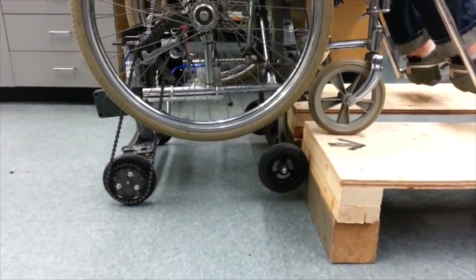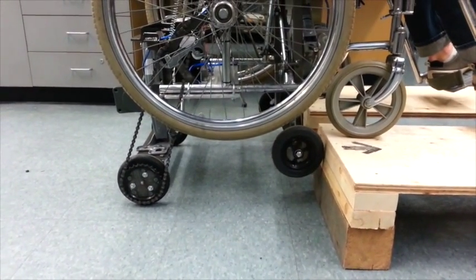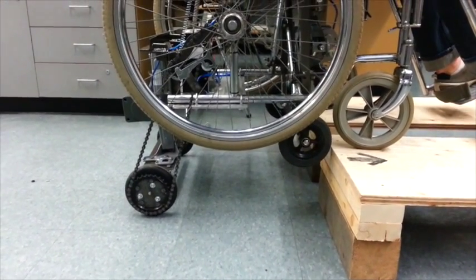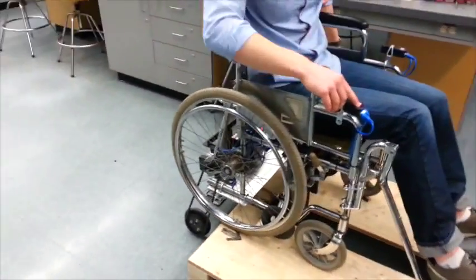Next, press the down button for the front axle to retract it, and if necessary, press the up button on the rear axle simultaneously to move the rear wheels to the proper height. Move the chair forward once again until all four wheels are on the curb.